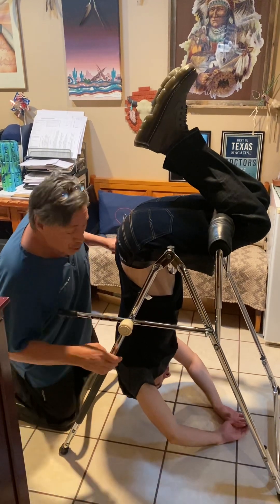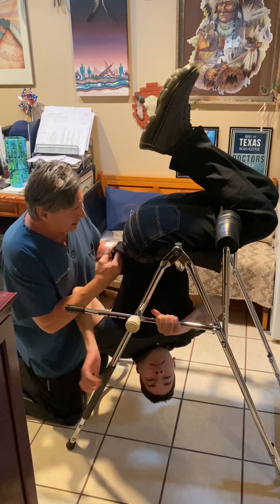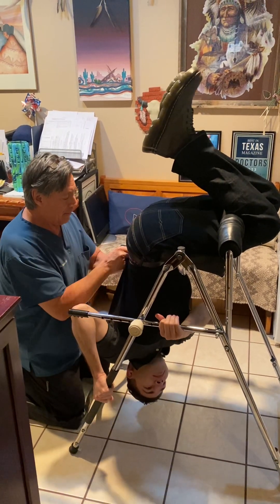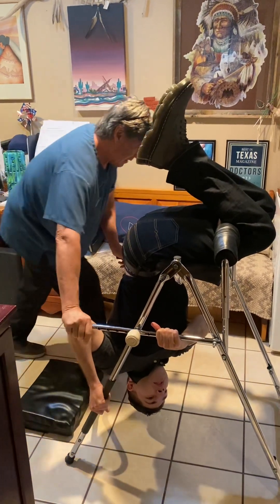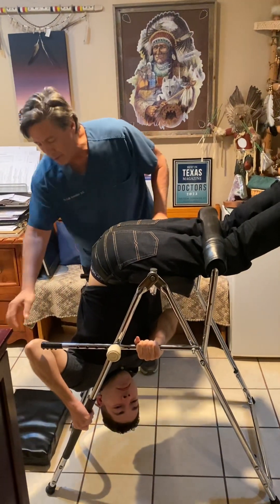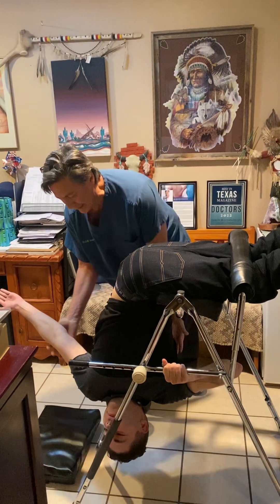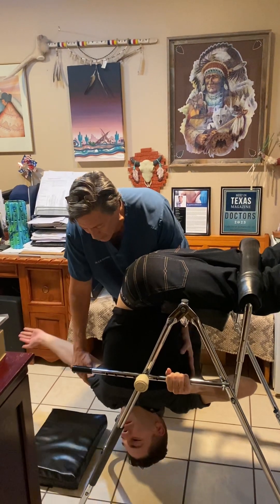Now I'm going to show you all some stretches. He's going to grab the bar right there. I'm going to try to tuck him in again. Does it feel better with your legs bent or extended? I prefer my legs extended. So now you can see he's doing this — he's not lifting his body, he's staying down there but he's twisting. You feel a stretch?